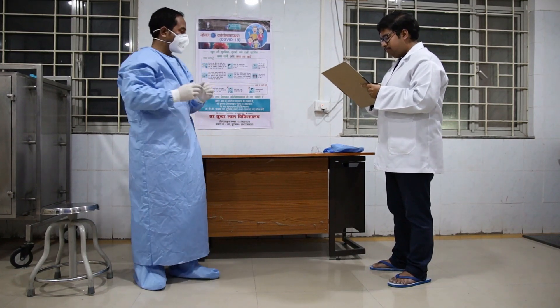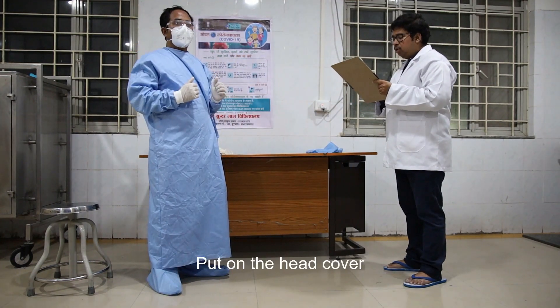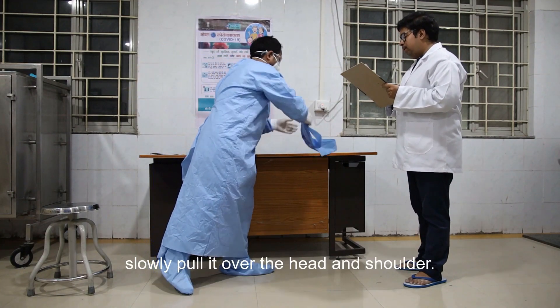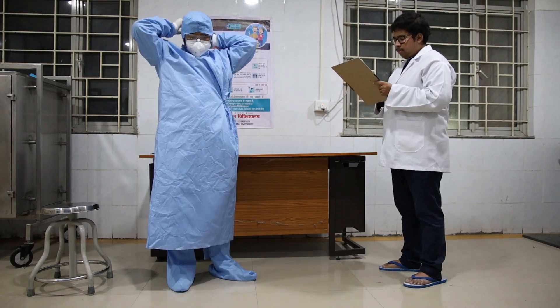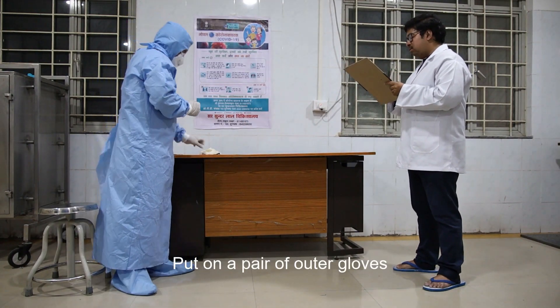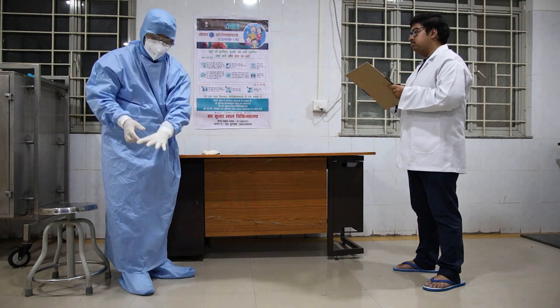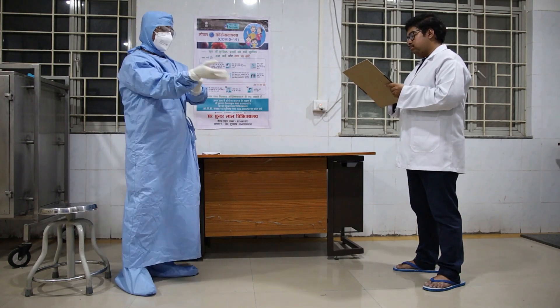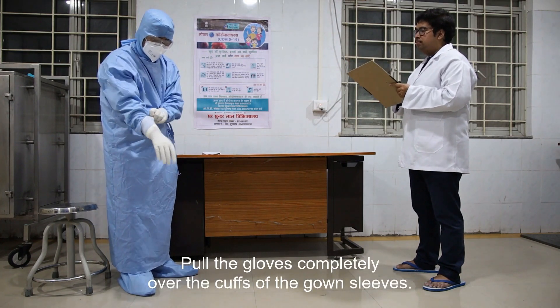Put on the goggles. Put on the head cover, slowly pulling it over the head and shoulders. Put on the pair of outer gloves, pulling them completely over the cuff of the gown slip.